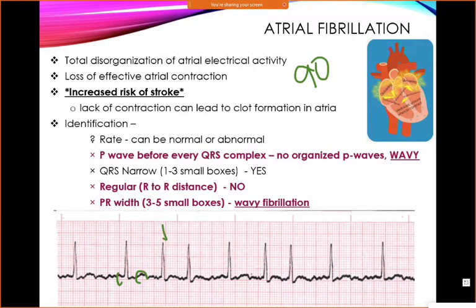Is it regular? So then we start looking. Let's go here to here. If this is 4.5 boxes, and then we go 1, 2, 3, and I've got a rate here. That one's a little shorter. This one's even shorter. And then we've got longer, and then longer. I've got all kinds of irregularness here. We've got short, long, short, long, short, long. It's irregular. And combine that with I can't read a standard P wave. We kind of stop here, and we call it irregular.